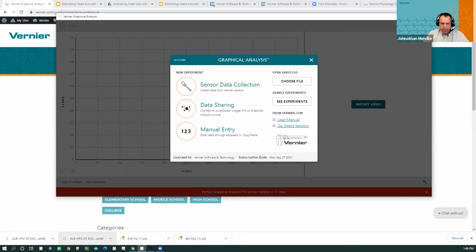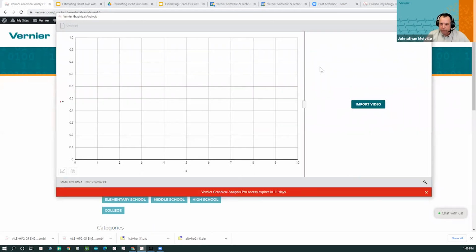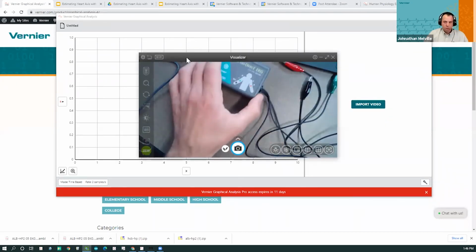Another cool thing that I should show you, just so you can see that the data is probably better over Bluetooth using an EKG trace is, hold on here. And the reason that has all to do with this idea of what we call noise. So let me turn on the camera here.